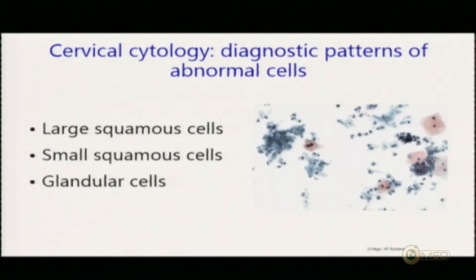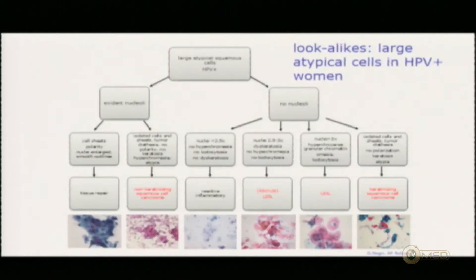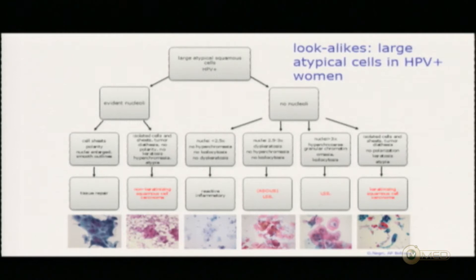Anyway, we are going to discuss these cells now. Of course, the first thing to do, as usual, is to decide what pattern you are dealing with. In that case, of course, we are speaking about large squamous cells. The differential diagnosis is quite simple. You have large atypical squamous cells, and the first decision is: do you see nucleoli or do you not see nucleoli? Because if you see nucleoli, the main differential diagnosis will be between tissue repair and squamous cancer, non-keratinizing type.